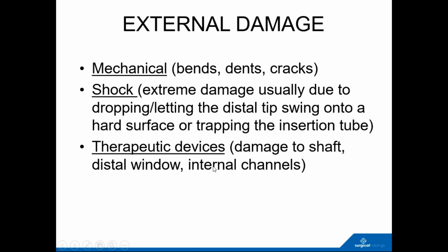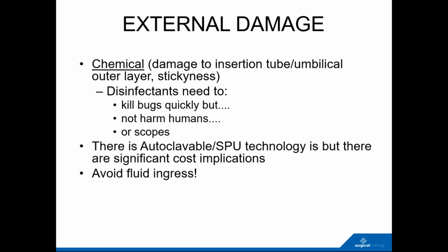If you had that in a U right at the tip in the kidney, and then you pass a laser fiber down to start chipping away at the stone that you're looking at, if you've got a sharp laser fiber going through a U bend in an endoscope, obviously it may puncture as you're passing it through. There have also been many instances of lasers being fired inside scopes, and obviously that leads to significant damage in the internal channels. And the thing that you really want to avoid and not get involved with is fluid inside the scope. There can be chemical damage.